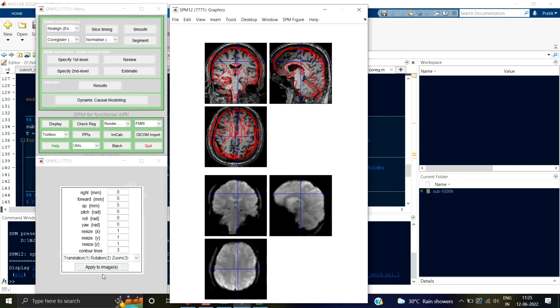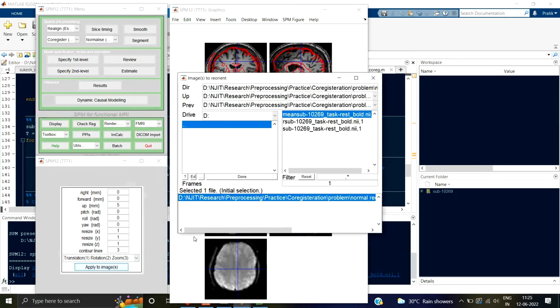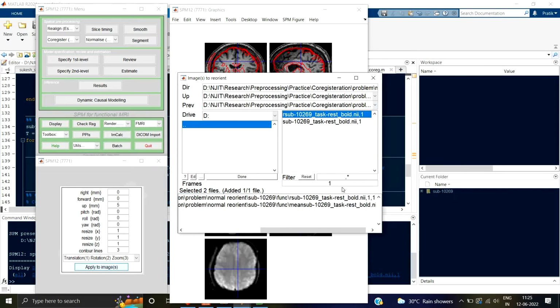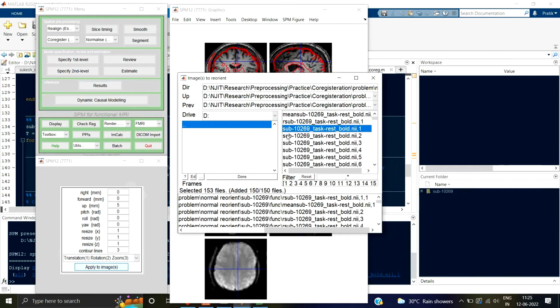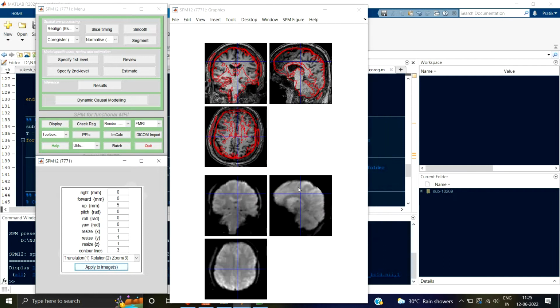Okay, so when you're done with this, say apply to image. When you do that, it'll ask you which images you want to reorient. We want to reorient all the functional images. You can also reorient the mean image. So over here I have the mean and the first slice. Let me start with the second up to 152. I don't need to reorient these because these are the images from before realignment, the original raw images. So you can just reorient the realigned images. Okay, press done.